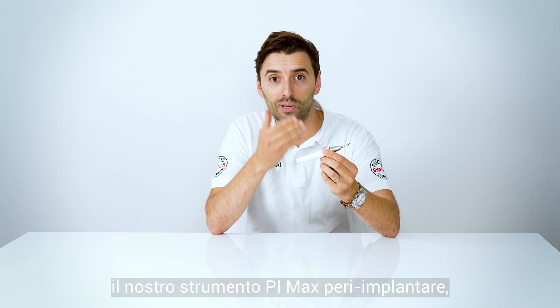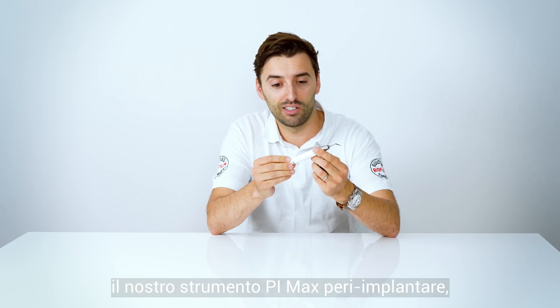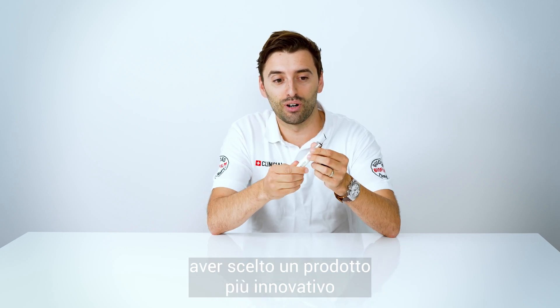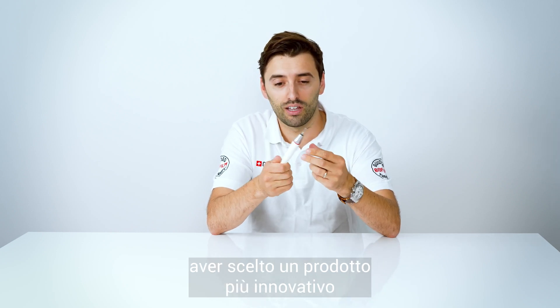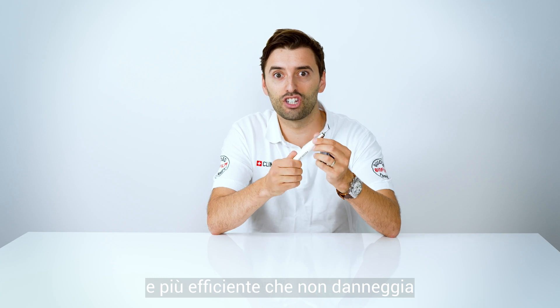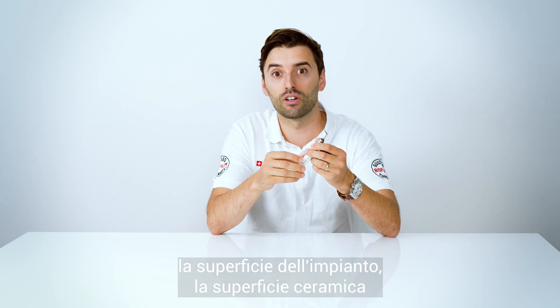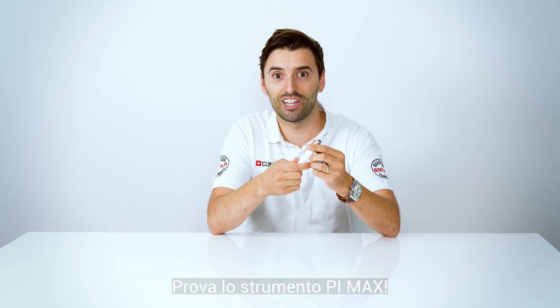Use our PI Max peri-implant instrument — you can see the difference and you're going to be happy to change to a more revolutionary and efficient product that doesn't damage the implant surface and doesn't damage the ceramic surface of the veneers and the crowns. Get yours!